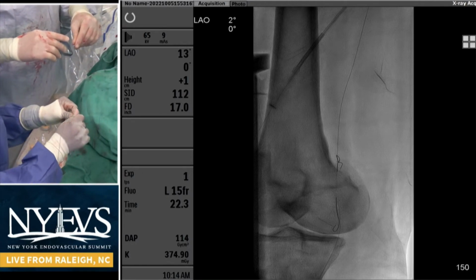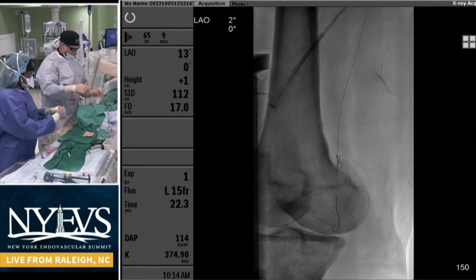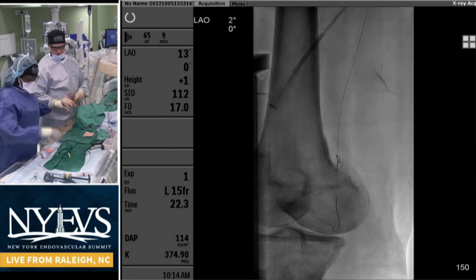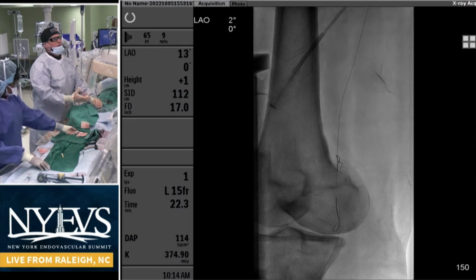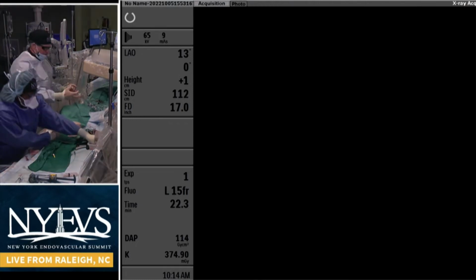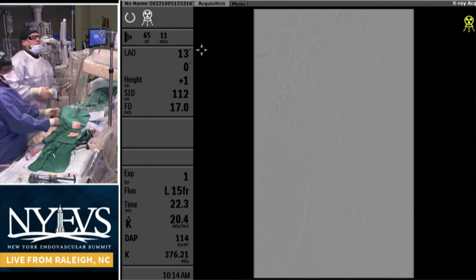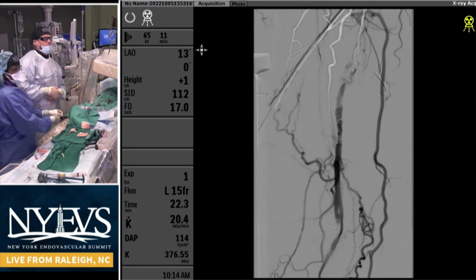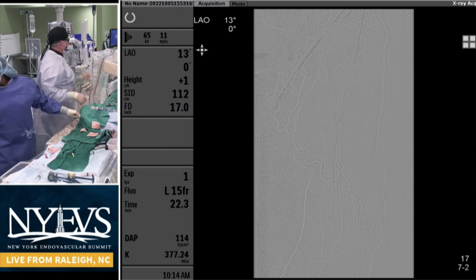All right. Okay, so I guess we're just switching our wires back in and we balloon. So let's see if you have any pictures. I want to ask George if you can hear. Yeah, hold on, I'll show you what we've done. All right, I'm going to open up this sheath from below just so it'll get good flow. Look at that. So we've got a connection somewhere.